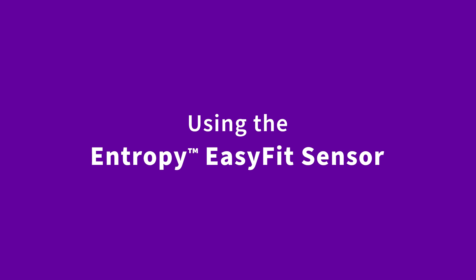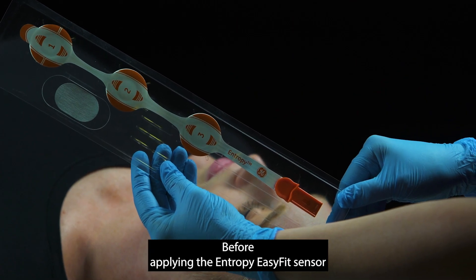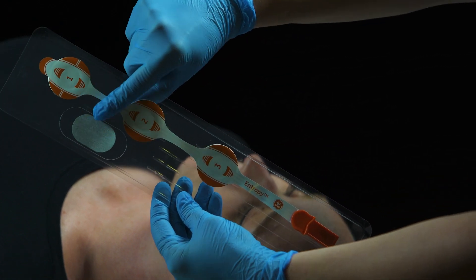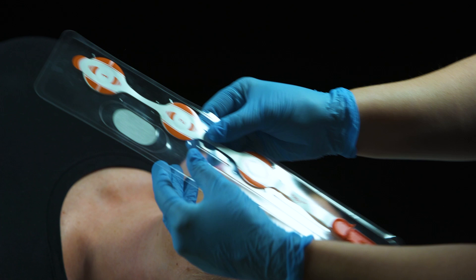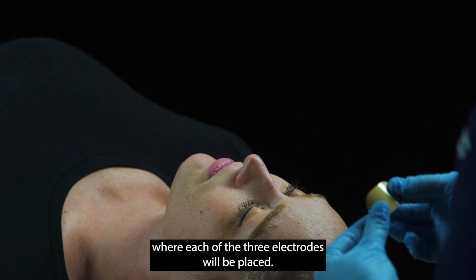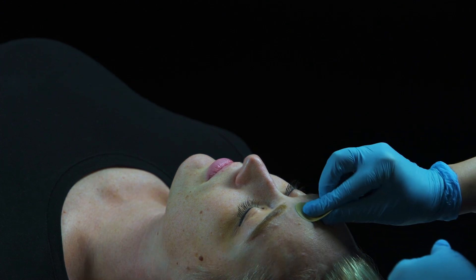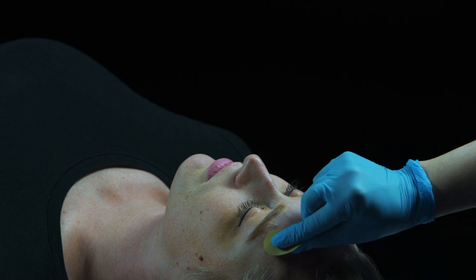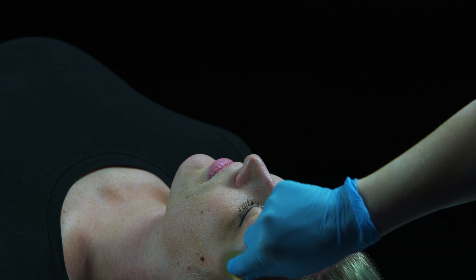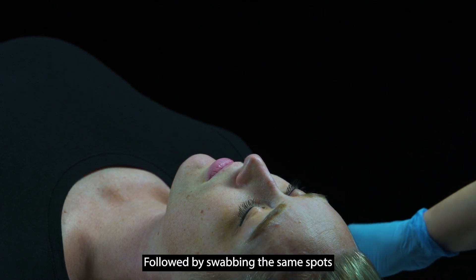Using the Entropy Easy Fit Sensor. Before applying the Entropy Easy Fit Sensor, make sure to prep the patient with the included skin prep pad. Gently swipe the patient's skin where each of the three electrodes will be placed, followed by swabbing the same spots with rubbing alcohol.